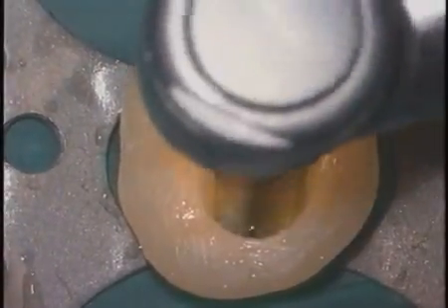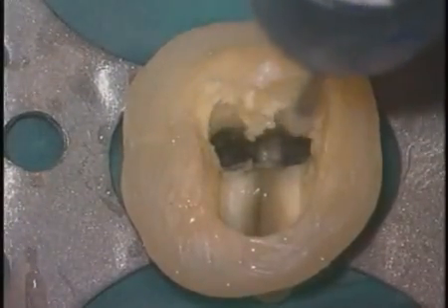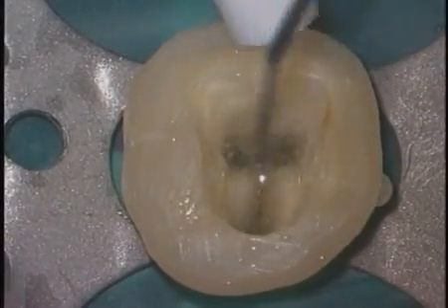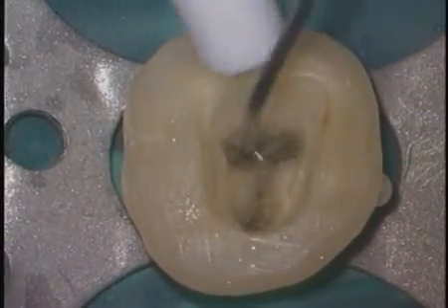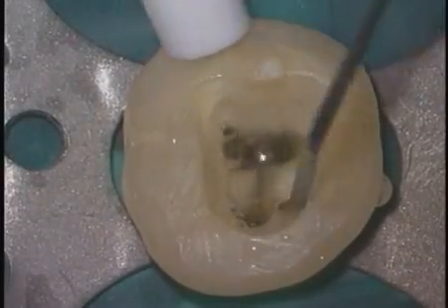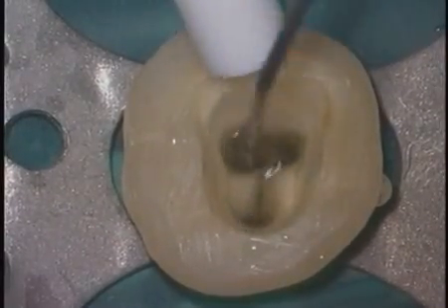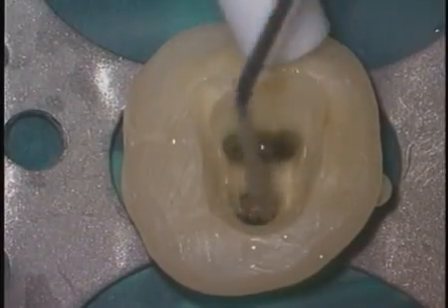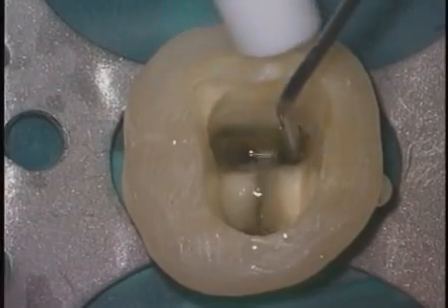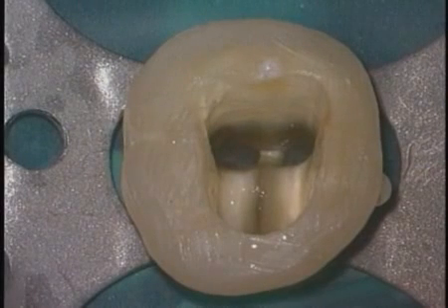Gates Gliddens are excellent for moving the canals away from furcal danger and smoothing the transition angles from the occlusal table into the orifice. During use, Gates Gliddens generate a lot of dentinal mud. Irrigation procedures are critically essential to float all the debris coronally where it can be cycled off the tooth. With the canals cleansed and enlarged at the orifice level, we can aspirate out the solution and we can begin to think ahead of getting the shape.